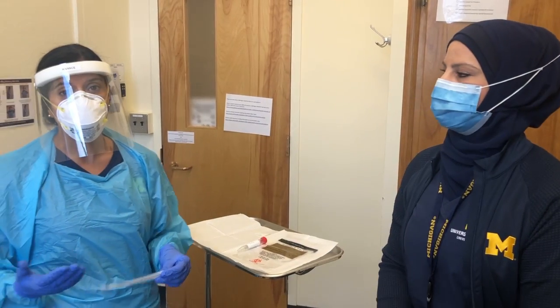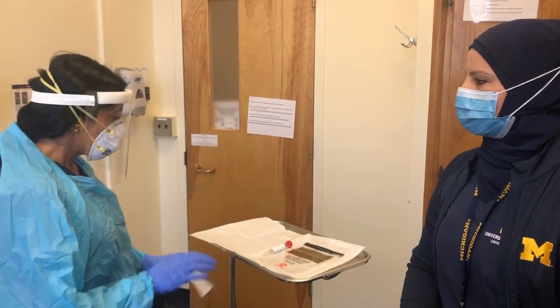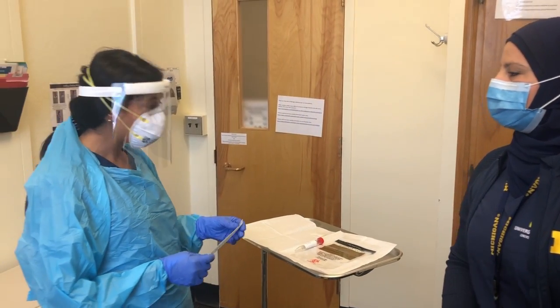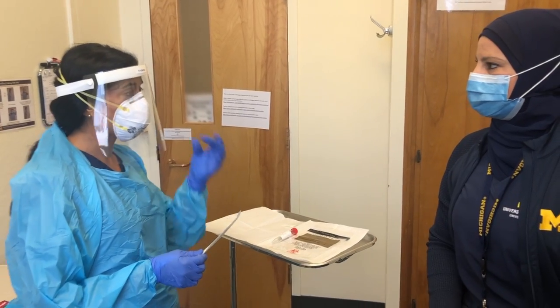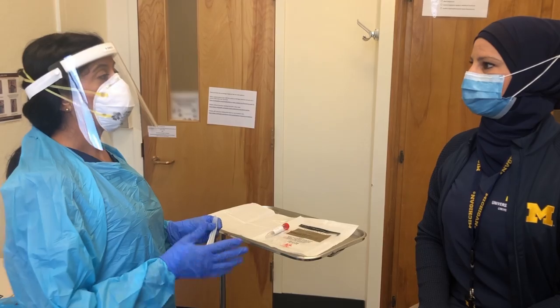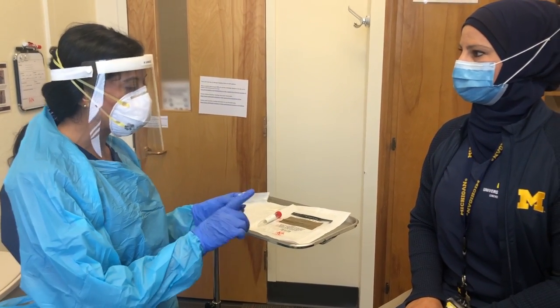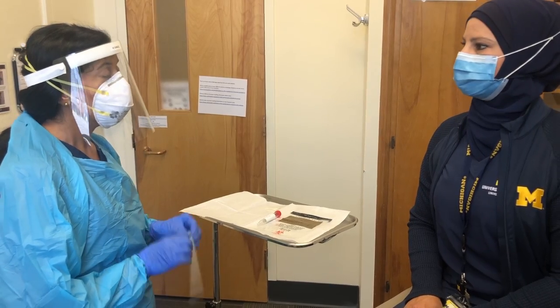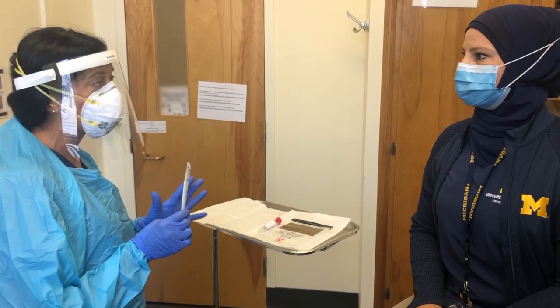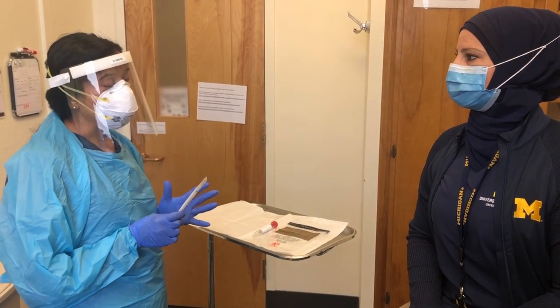Next, I'm going to explain to her what the procedure is like so she knows what to expect. So this is called a deep nasal or mid-turbinate swab, which you're going to perform on yourself. When we're ready, I'm going to have you remove your mask so that only your nose is exposed. Then you're going to tilt your head back about 20 to 30 degrees. You're going to open your swab, being careful not to touch the tip of your swab. You're going to gently insert this into one nostril until you hit resistance. In general, that's about 3 to 4 centimeters or 1.5 inches.